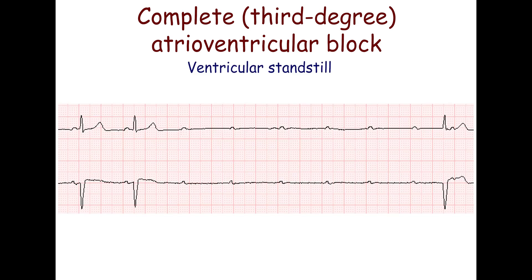If no escape rhythm occurs during complete atrioventricular block, ventricular standstill and ventricular asystole will result. This ECG strip shows complete atrioventricular block leading to ventricular standstill. The first two QRS complexes are of sinus origin with normal PR intervals, followed by six non-conducted P waves and a pause of 5.6 seconds. The last QRS complex is of junctional origin. This is one of the most life-threatening rhythm abnormalities.